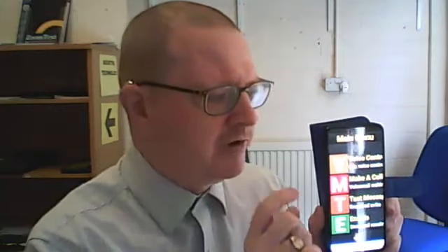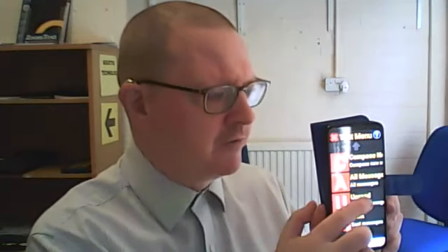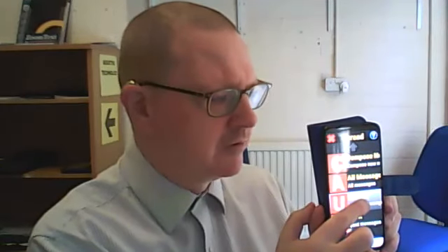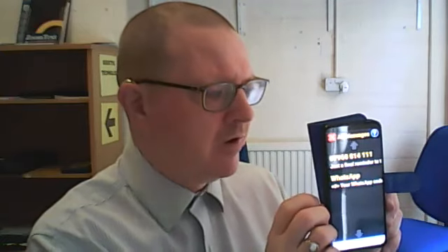The next option here is text messaging. Now, this is very easy. Text messages, read and write. Text menu, page 1 of 3. Let's see. I'm going to see how many text messages I've got. Unread, show unread messages, send, show unread, show all messages, page 1 of 1. And I'm going to find the text message here and read it.